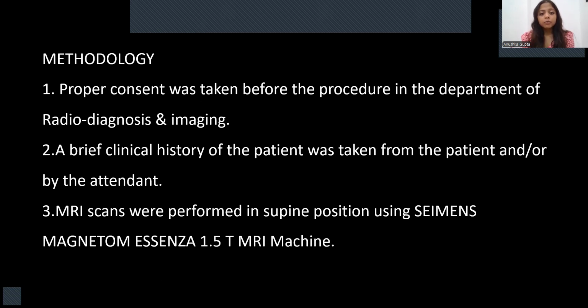Methodology was proper consent was taken before the procedure in the Department of Radiodiagnosis and Imaging. A brief clinical history of the patient was taken from the patient or by the attendant, and MRI scans were performed in supine position using Siemens 1.5 Tesla MRI machine.